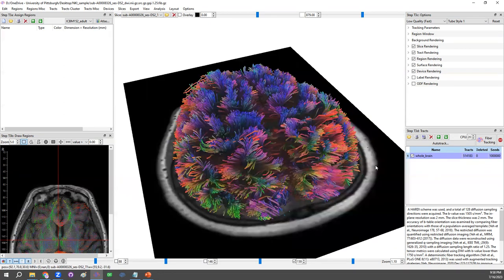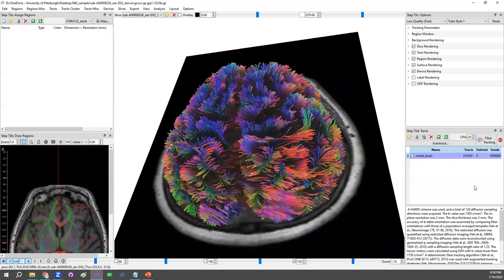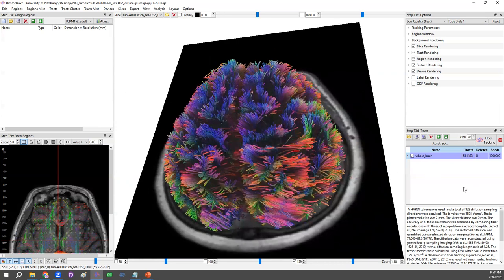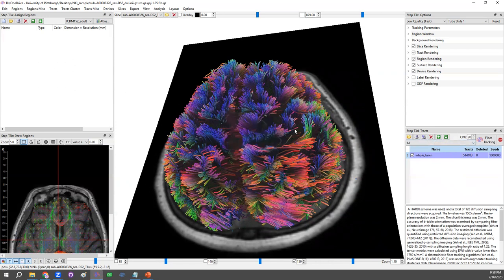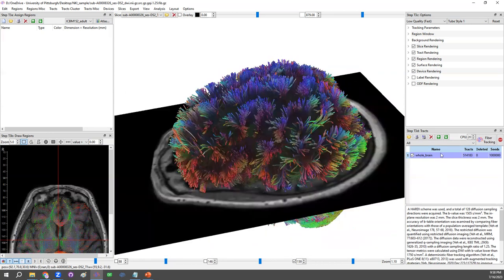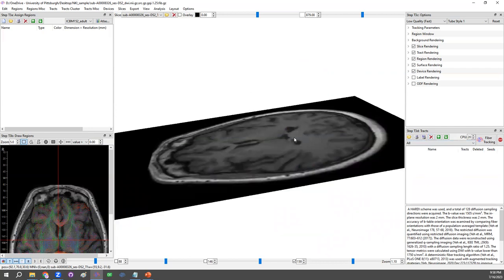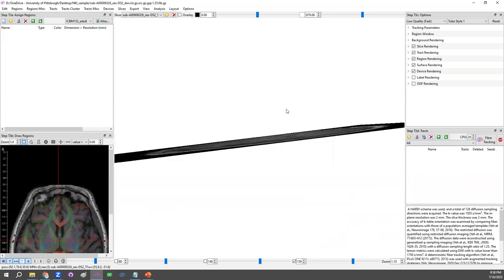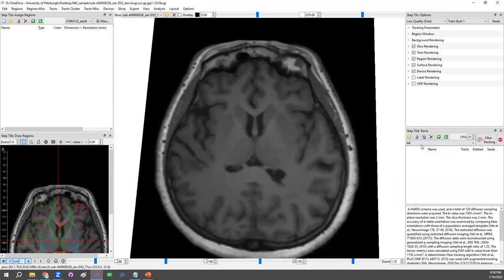And that's why we need automatic fiber tracking. So to enable automatic fiber tracking, click on the auto-track button. Then DSI Studio would run up normalization to bring in a tractography atlas and enable us to run automatic fiber tracking.